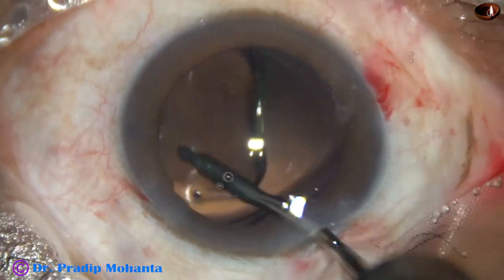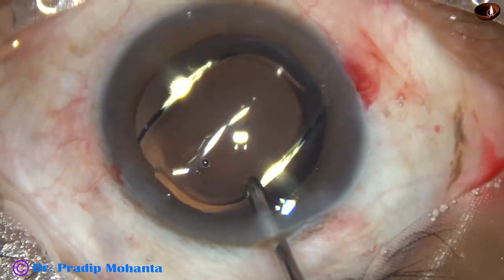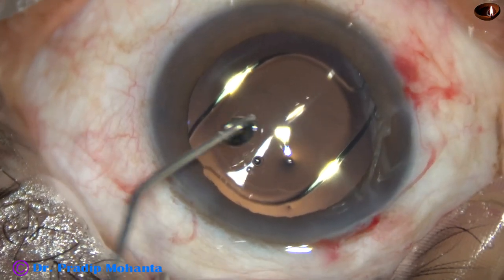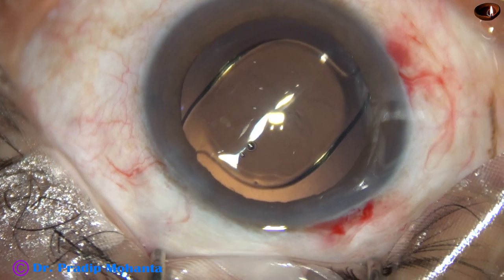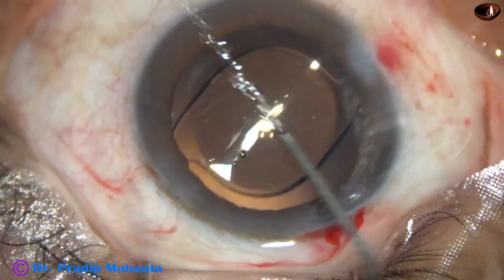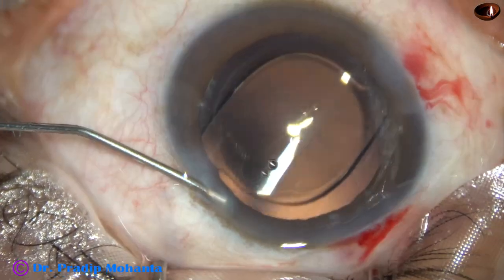This is a beautiful lens, no posterior capsular opacification, and very good optics, aspheric optics. The side ports are closed by corneal stromal hydration.